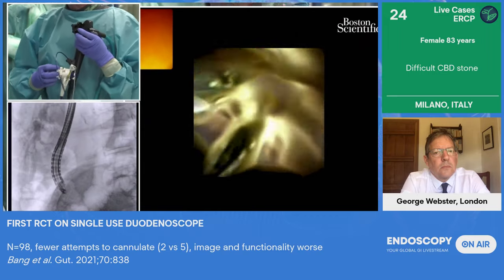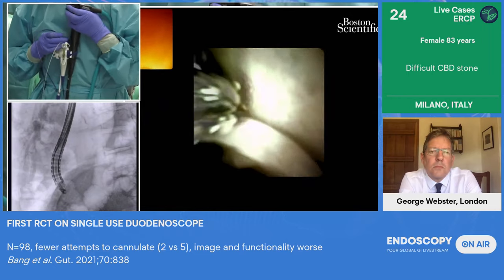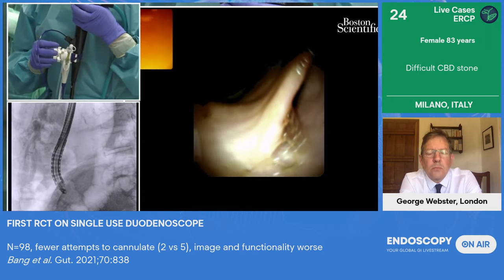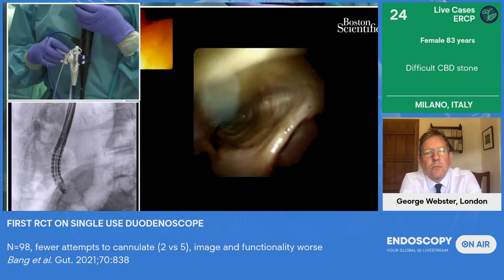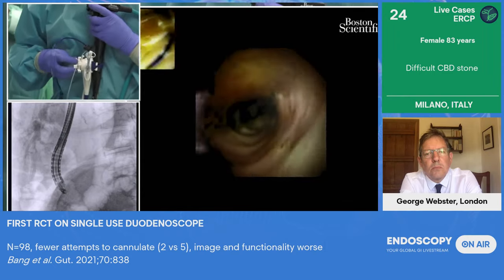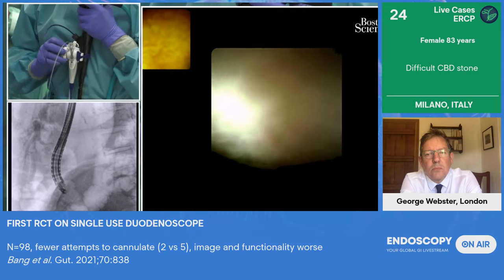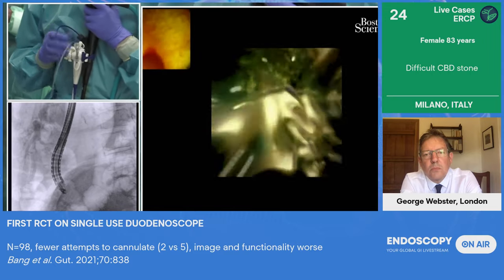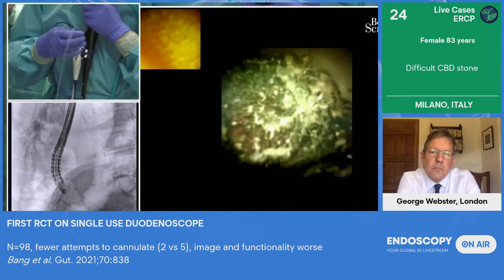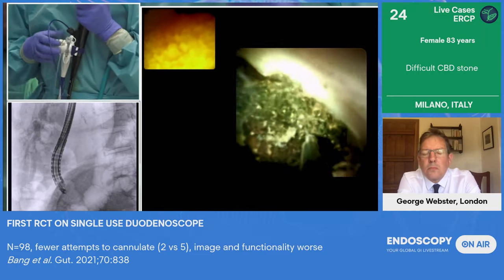to the endoscopic view. We are inside the bile duct, and you clearly see the cystic duct here. The lady had a cholecystectomy done with some problem as well. And here is the common bile duct. So I would like to go inside the common bile duct to see if there is still the stone that was described as a big stone. And here it is. As you can see, we are facing directly the stone that is going up into the proximal part of the common bile duct.